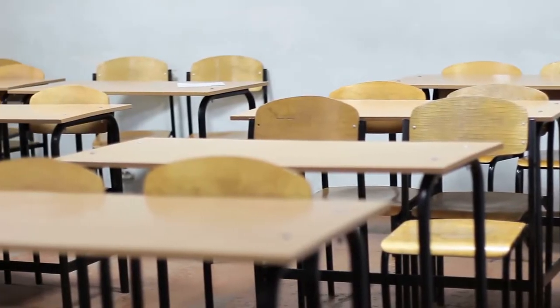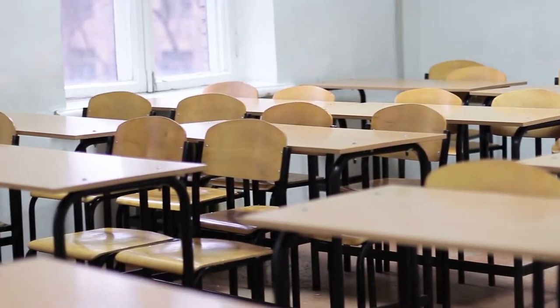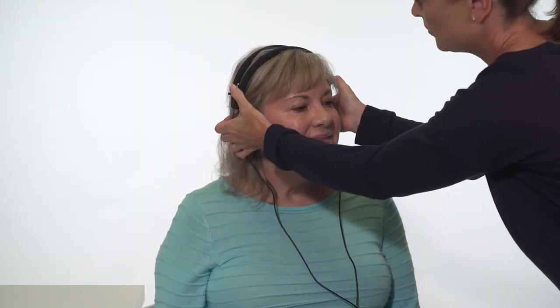The first step is to find a screening location. Look for a quiet location away from distractions such as high traffic hallways, copiers or printers, or windows to a playground, for example. Verify this level with a dosimeter or perform a hearing screening on a normal hearing individual to verify all frequencies and tones can be heard below the screening level.